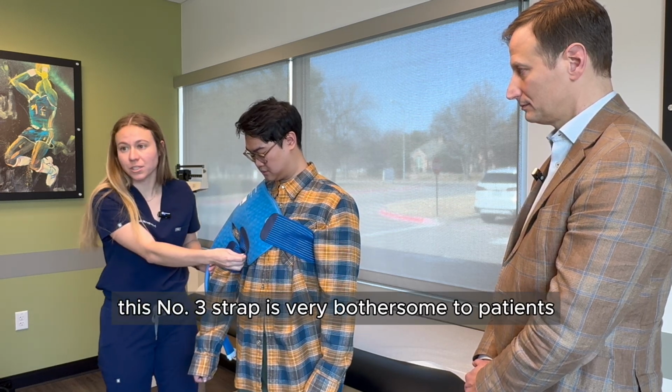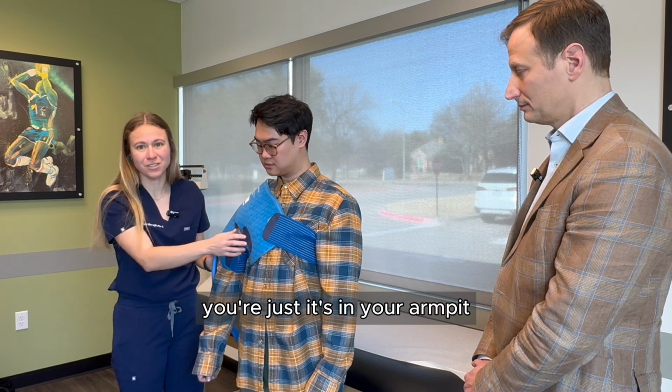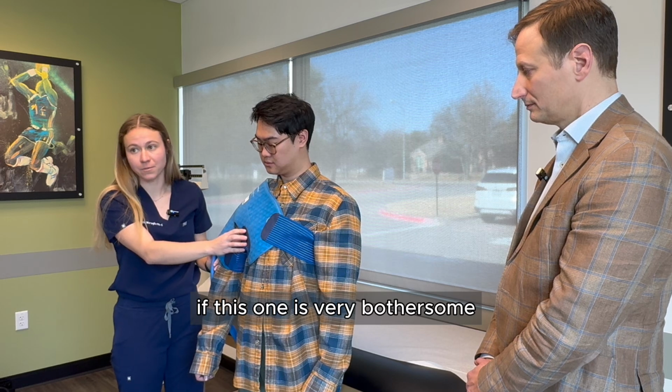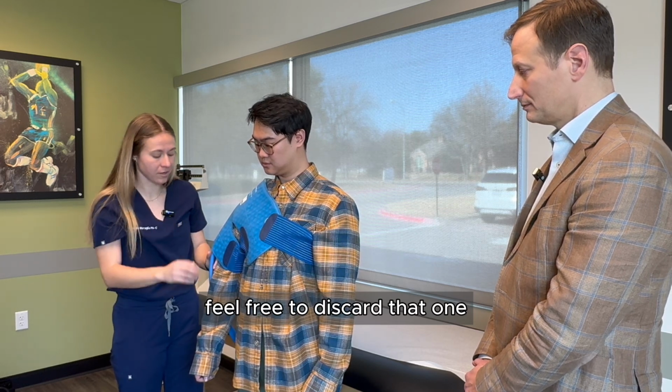Sometimes this number 3 strap is very bothersome to patients. It's in your armpit. And so this third one is optional. If this one is very bothersome, feel free to discard that one.